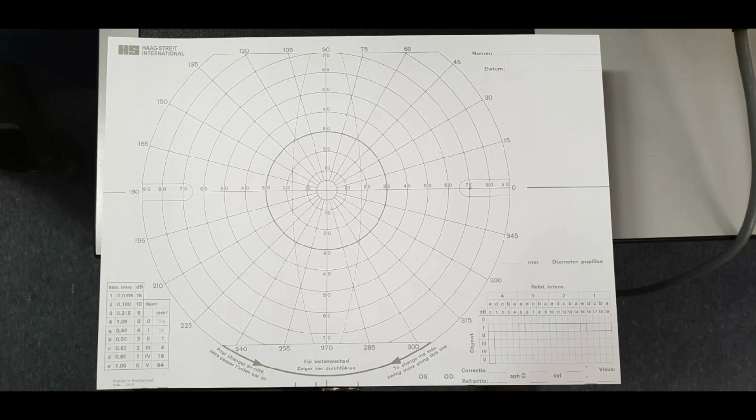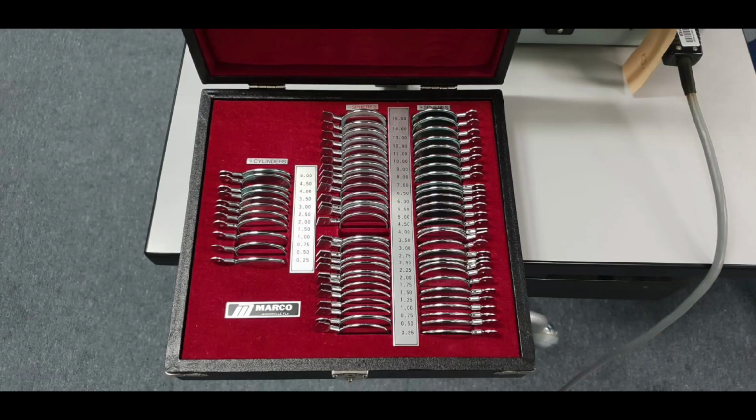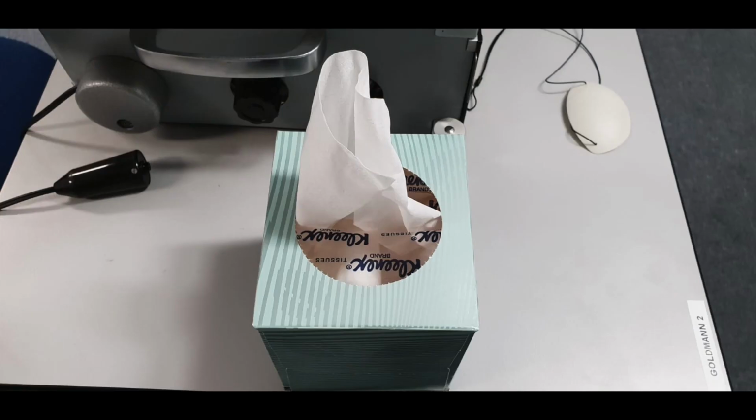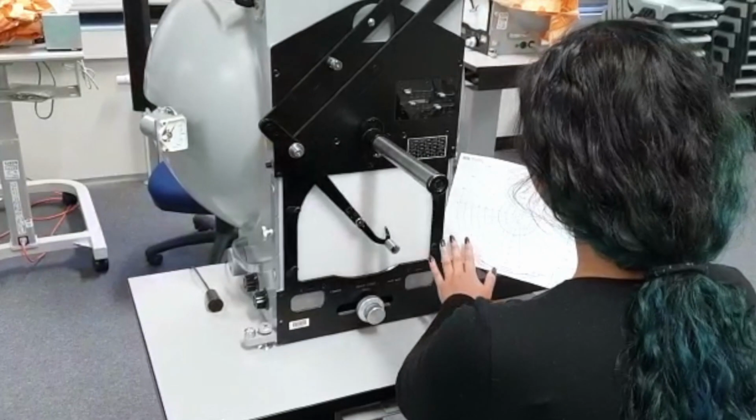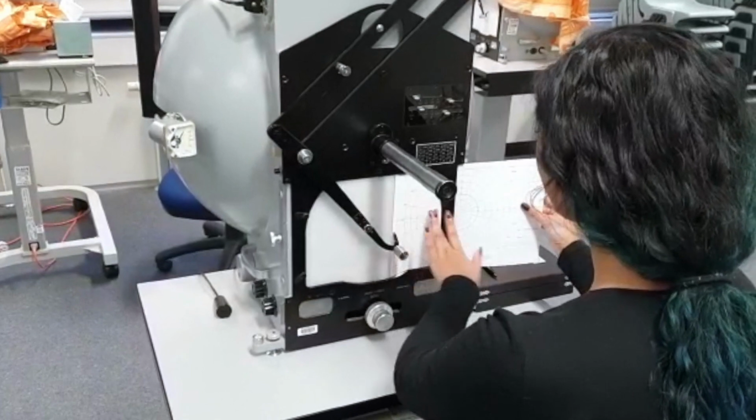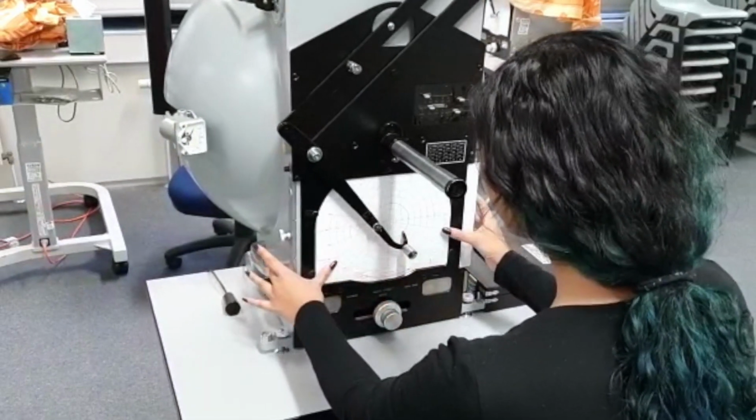Goldmann recording sheet, eye patch, trial lens set, tissues, and alcohol wipes. To set up the Goldmann, slide the recording sheet under the chart.